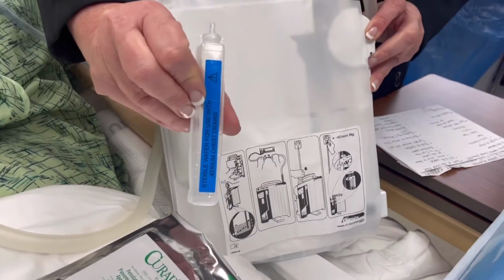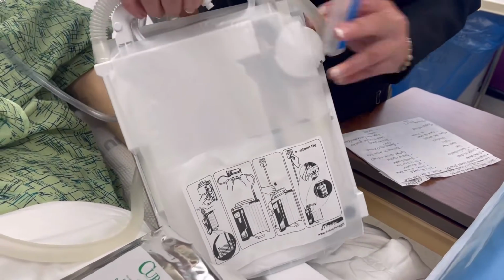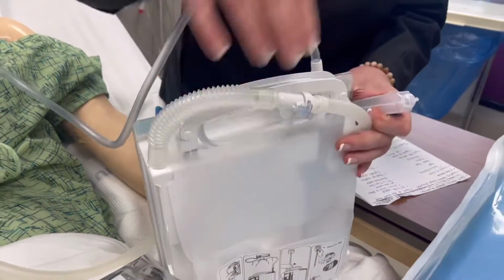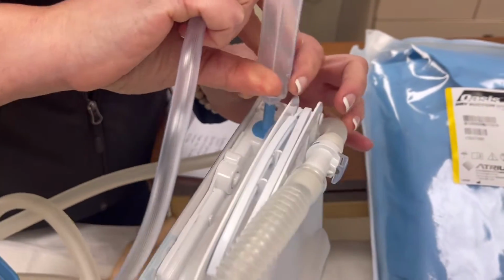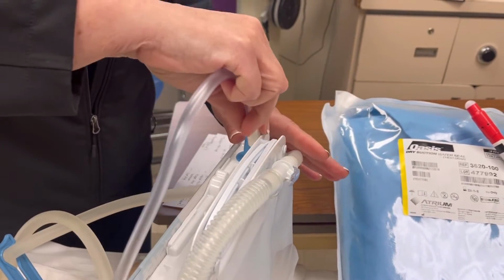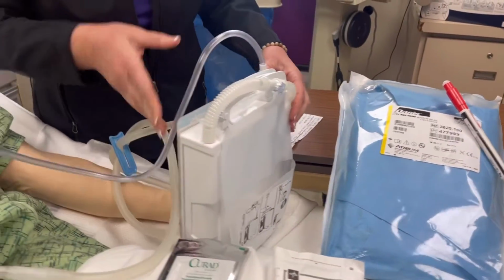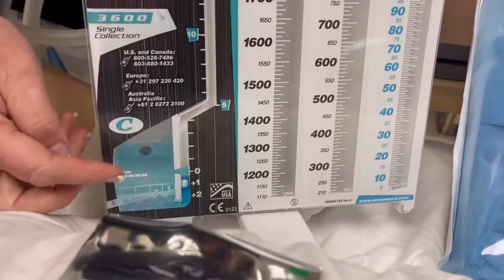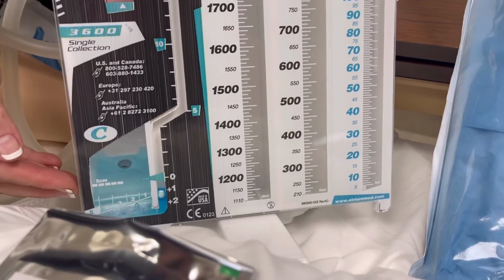On the back, you'll see this little container. It's filled with sterile water. It's actually located right here. You just pull it off. Think blue to blue, connect it, and empty all of the sterile water into the Atrium and connect your suction. That water fill will fill up exactly what you need. You don't have to add any water, and you don't have to remove any water.